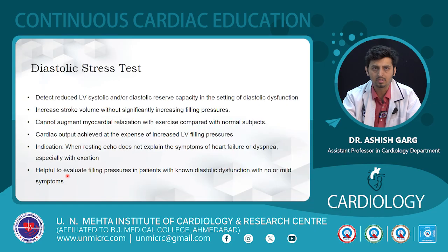So the diastolic stress test is used when the resting echo is not able to explain the symptoms of heart failure, especially with exertion, and it helps us to evaluate filling pressure in patients with known diastolic dysfunction with mild symptoms. What happens is that when you make the patient exert, the LV filling pressure increases, and you can pick that up with a diastolic stress test.